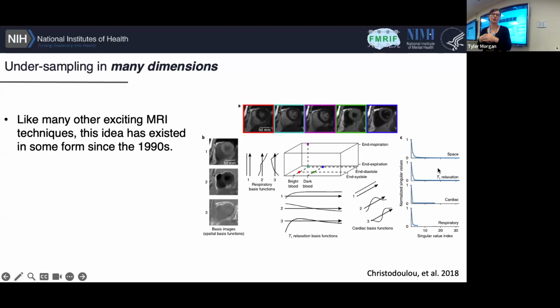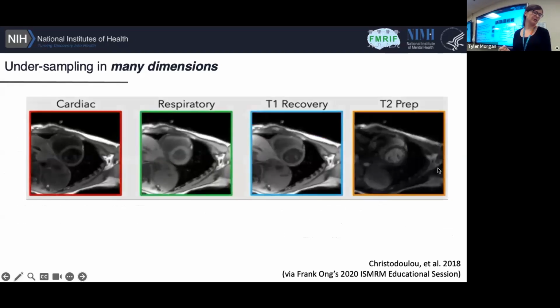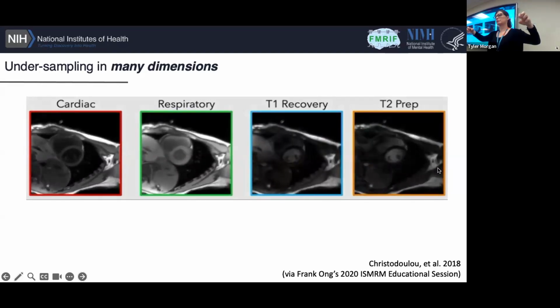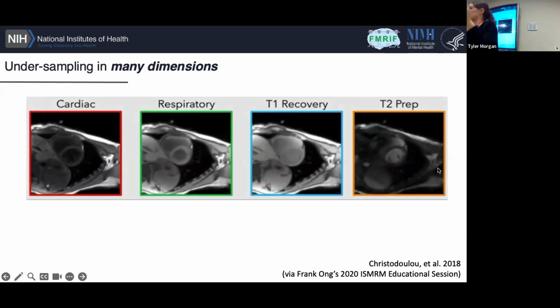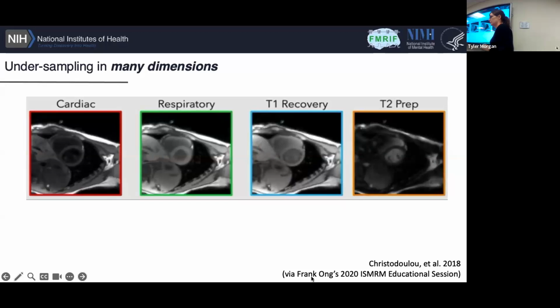And basically, tensor imaging is just trying to keep really, really good timing records for every single data point that you ever collect, and then trying to model them so that they can be separated. So this is the goal of almost all fMRI studies, to essentially separate different processes so that we can tell what's happening that's due to something we did. But here, they are doing it in the case of chest imaging.